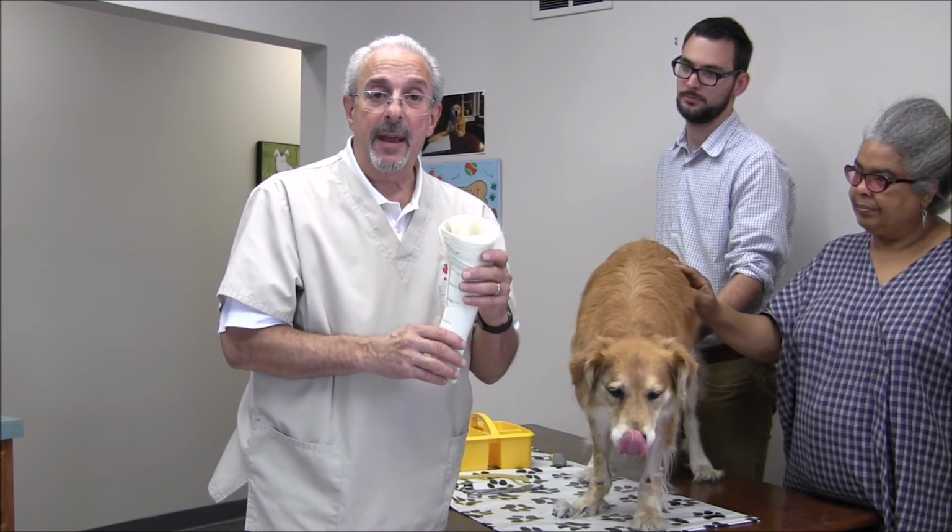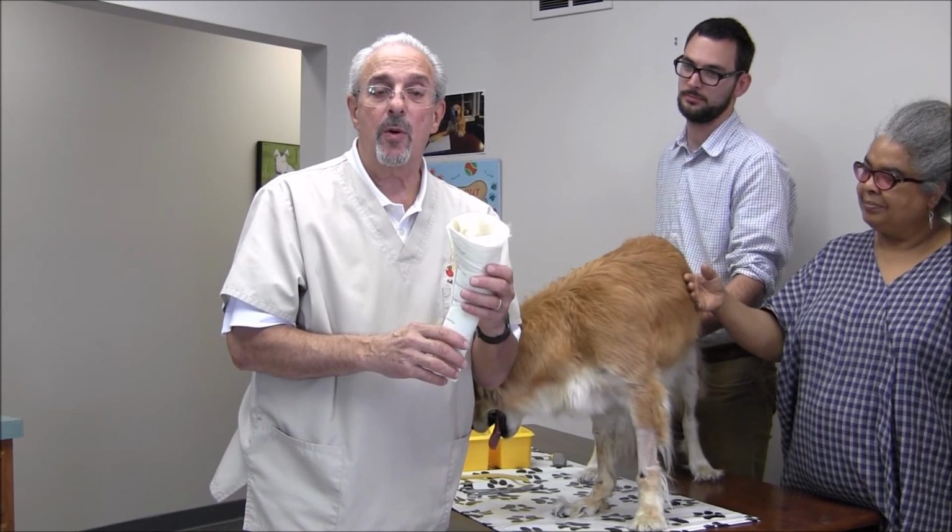That's all we need to do today. From there you can go ahead and take measurements according to the measurement sheet.